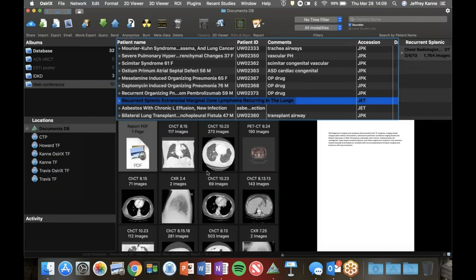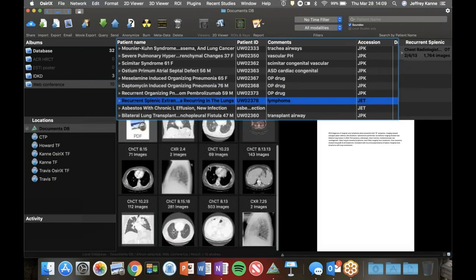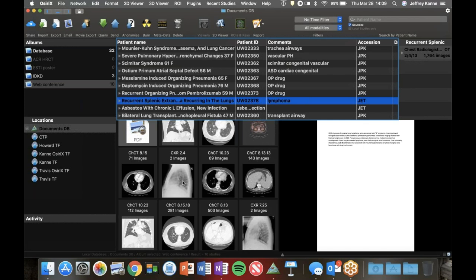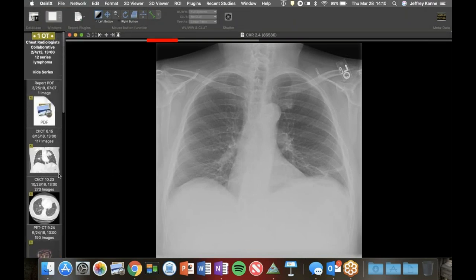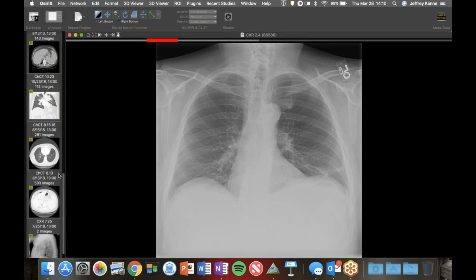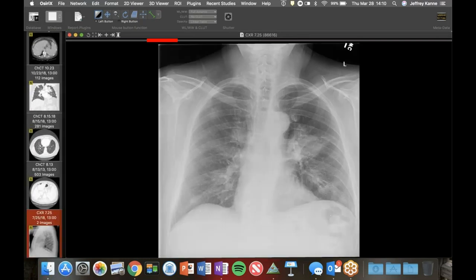Here's a case Julie sent me. This is a patient who has a history of extranodal marginal zone lymphoma that involved only the spleen - back a long time ago, with no lung involvement. But then presented with some symptoms, and you can see there are nodules in the lung and a mass on both sides.